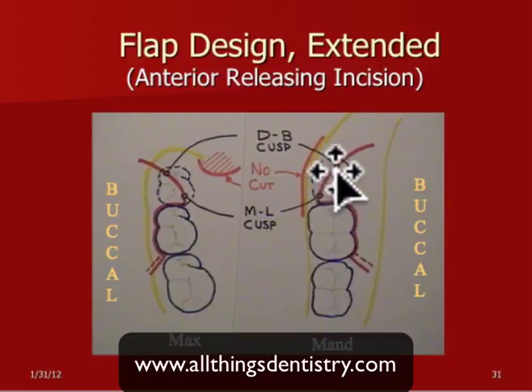If you do have to remove this area to deliver the tooth, you can simply just reflect it real gently. Don't stretch it out because, again, the lingual nerve may be in there. 5% of the cadaver studies show that the lingual nerve comes almost immediately distal to the third molar and right along almost the lingual surface of the third molar. So you want to stay away from the lingual nerve. It's bad enough cutting an inferior alveolar nerve, but the lingual nerve has a lot of proprioception. So if you numb that up, every time they talk, laugh, sneeze, cough, they'll remember you. So you want to preserve that lingual nerve at all costs there.